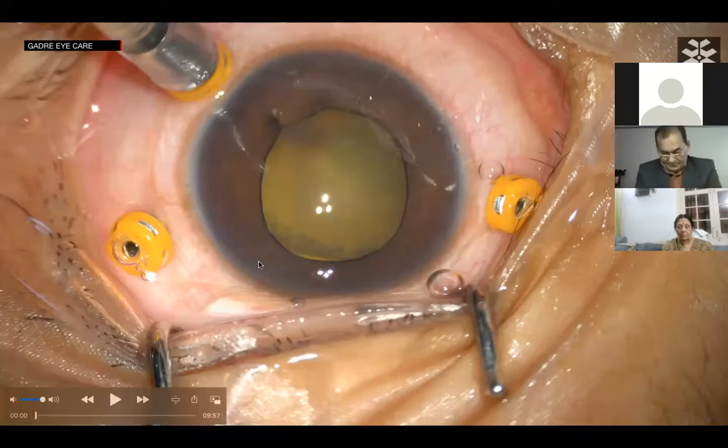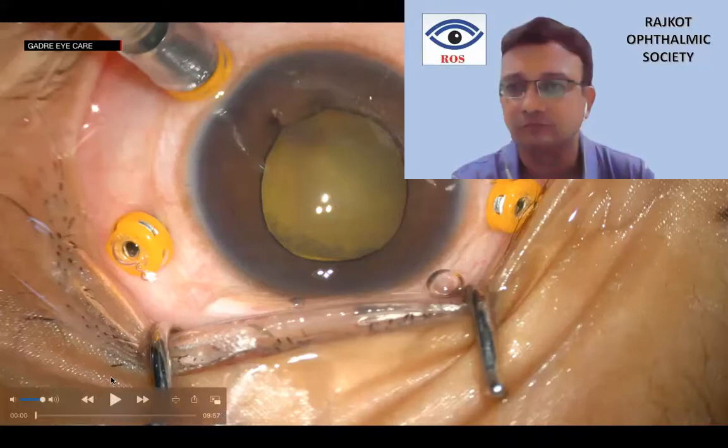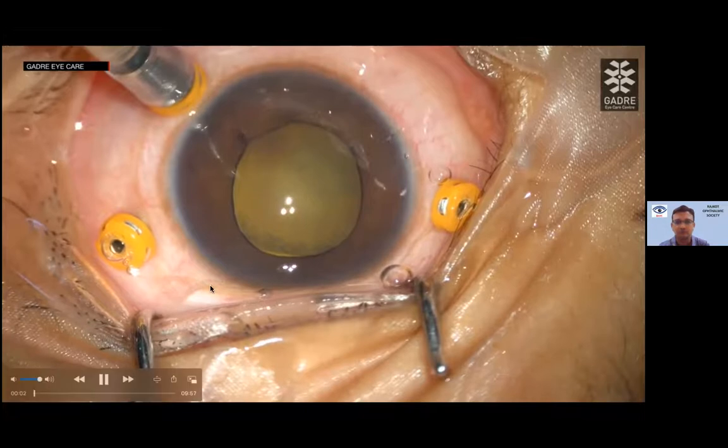Seeing the advanced grade of retinal detachment, they were already advised against surgery. The same thing I did when I first counseled them, but they were insistent that they wanted to try. So under the risk of abandonment of surgery, the risk of phthisis and need of multiple surgeries, we proceeded with the surgery. So starting the video.